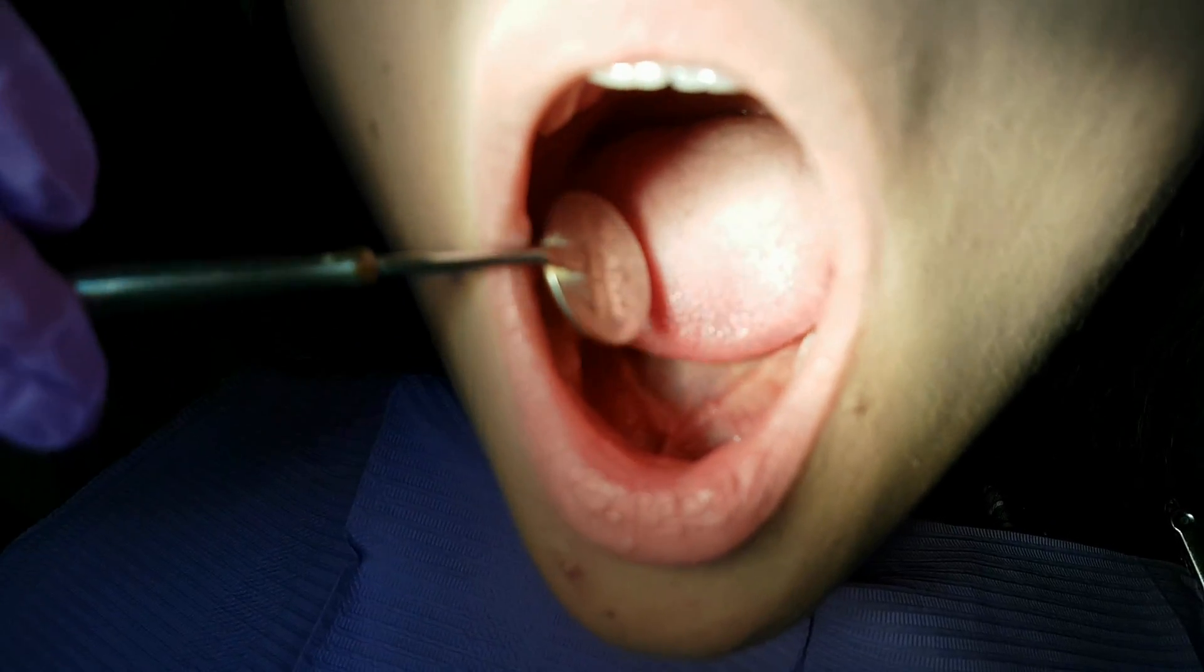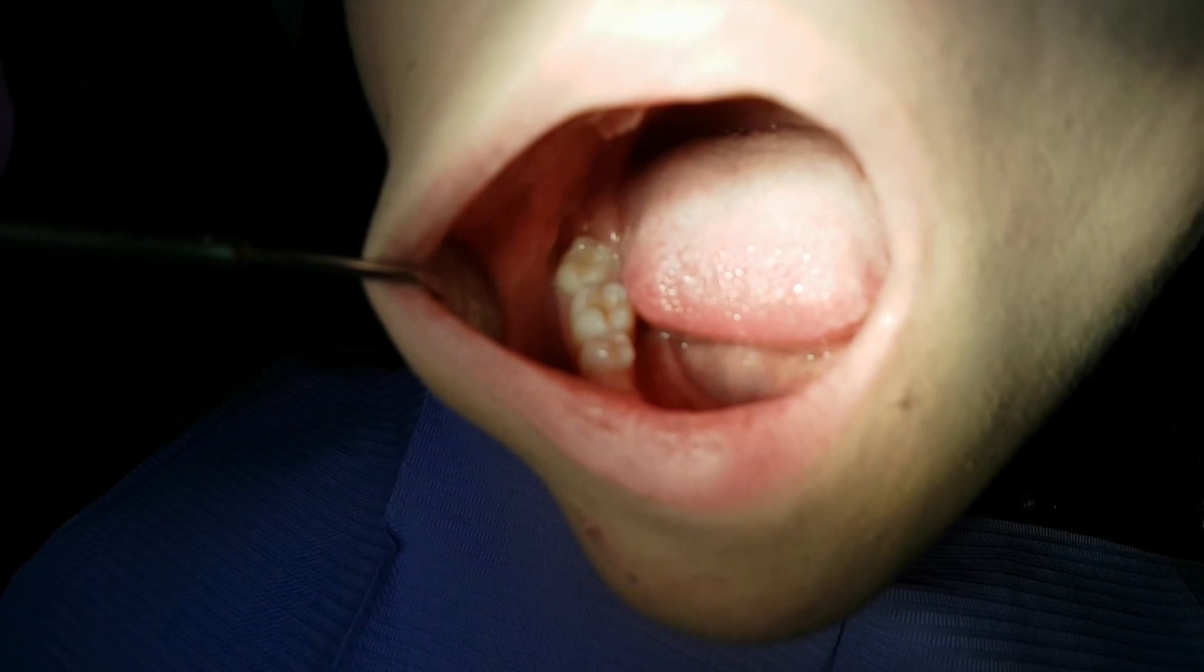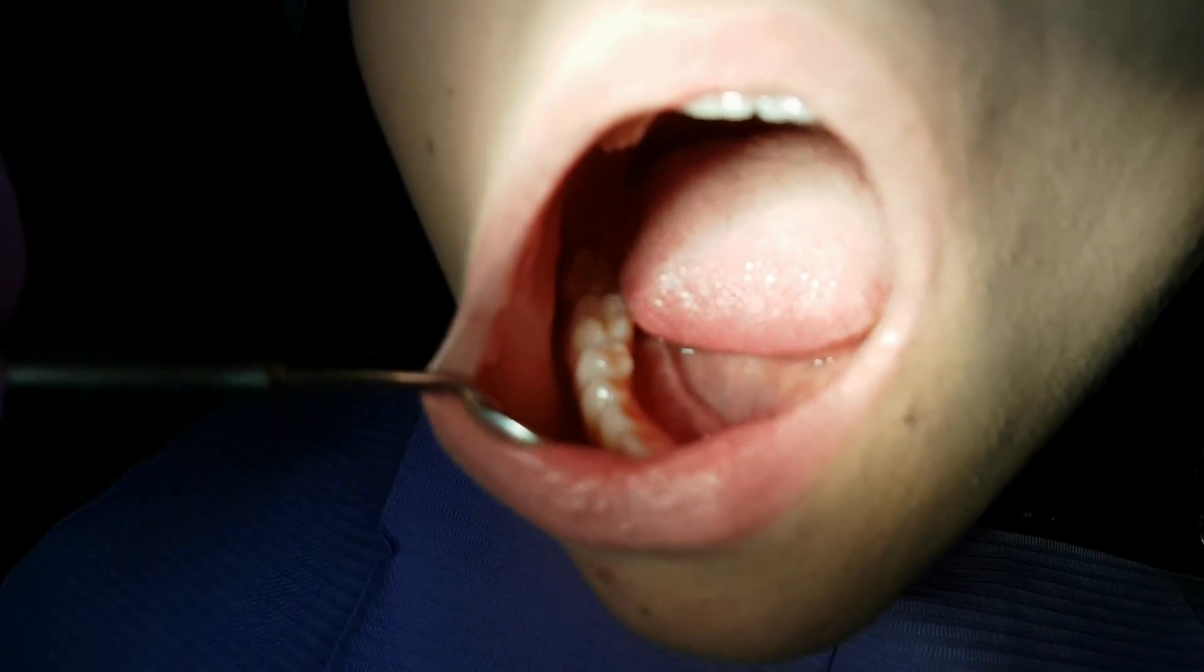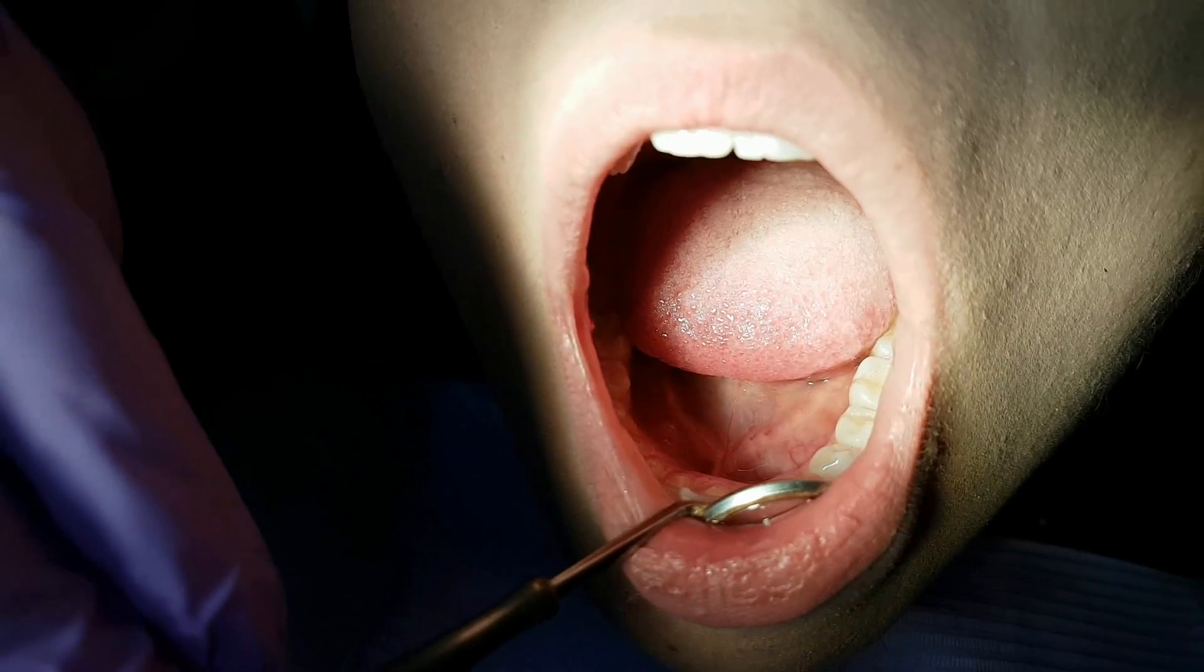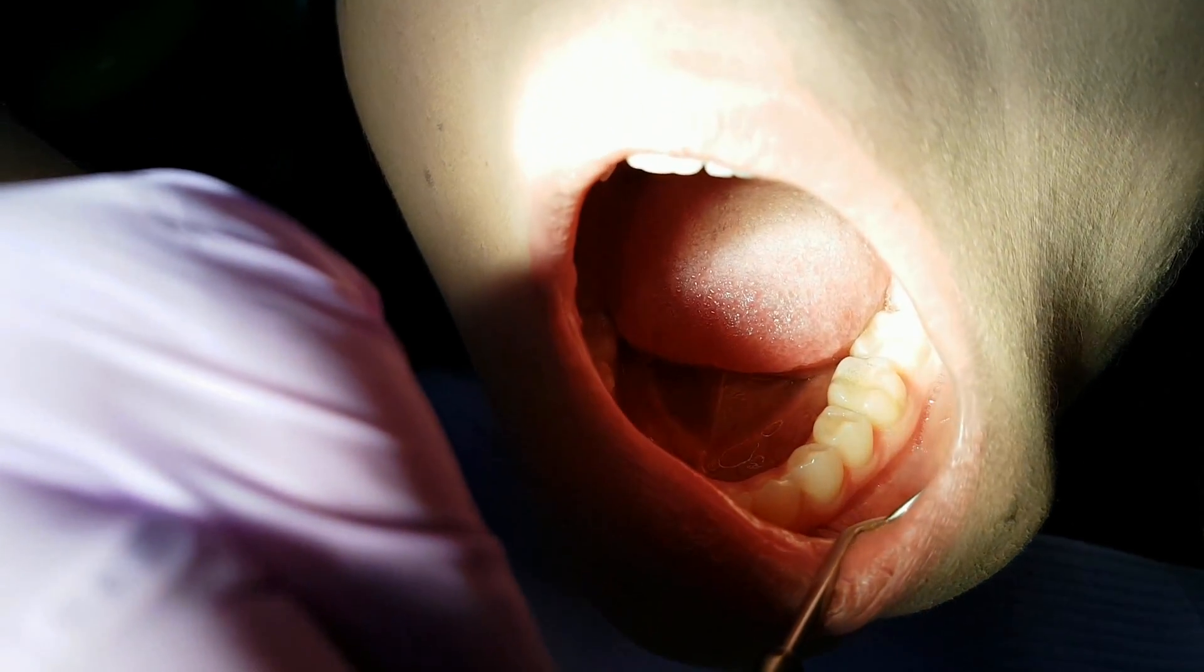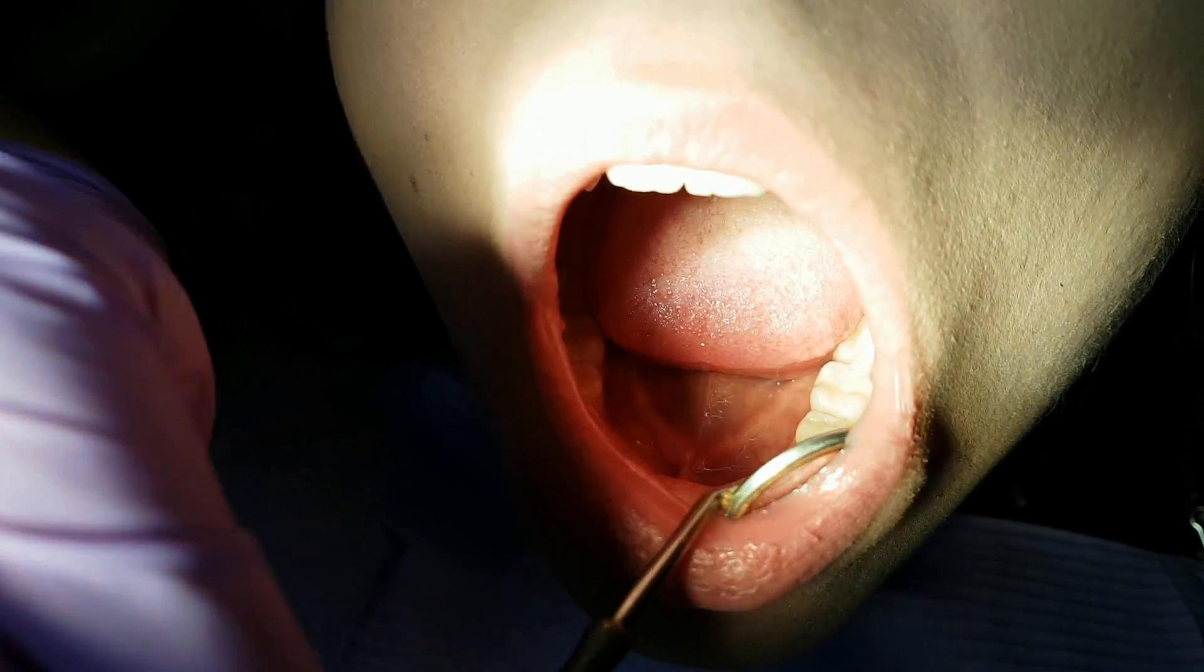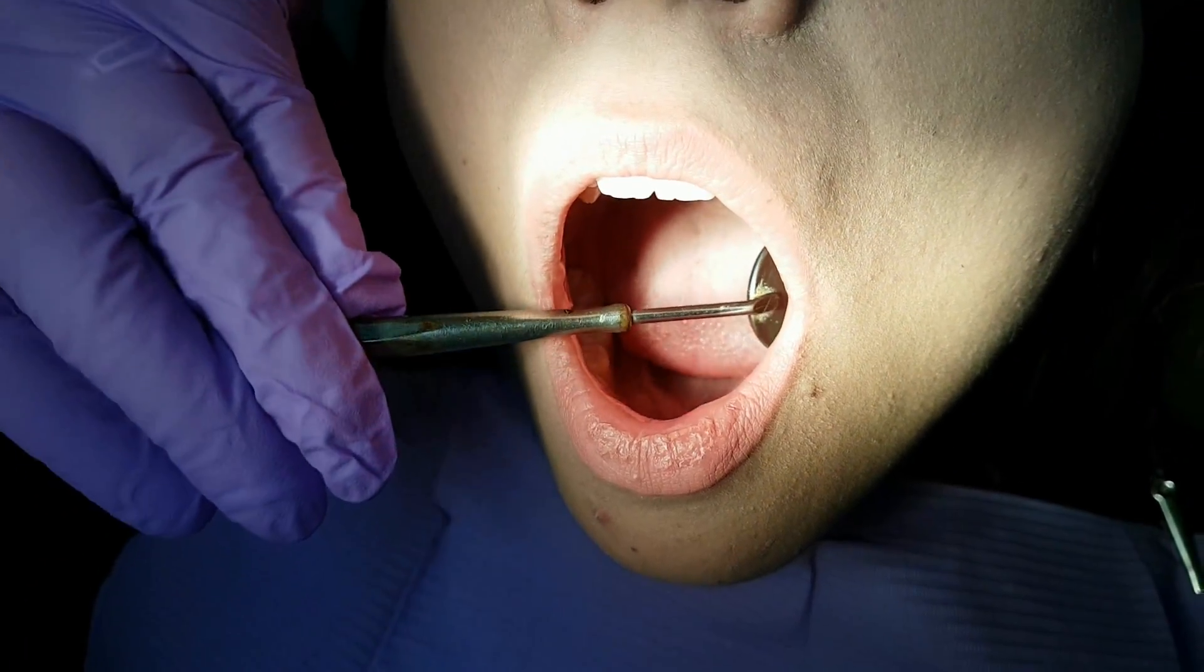This is how a dentist mirror and a dentist explorer are used in a patient's mouth. This is how the dentist retracts using the dentist mirror soft tissues such as the mouth and the tongue.